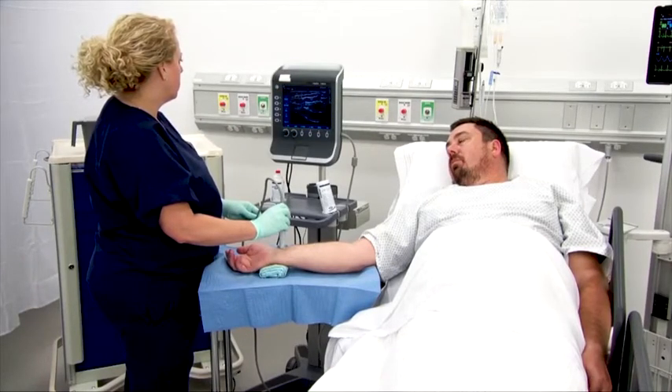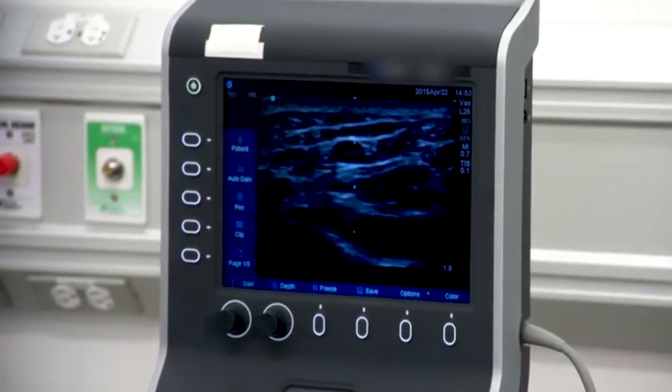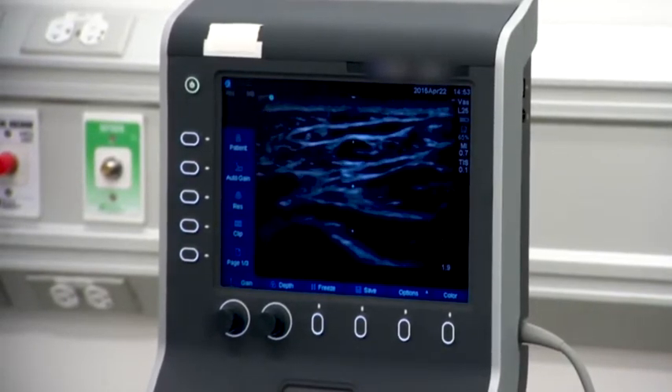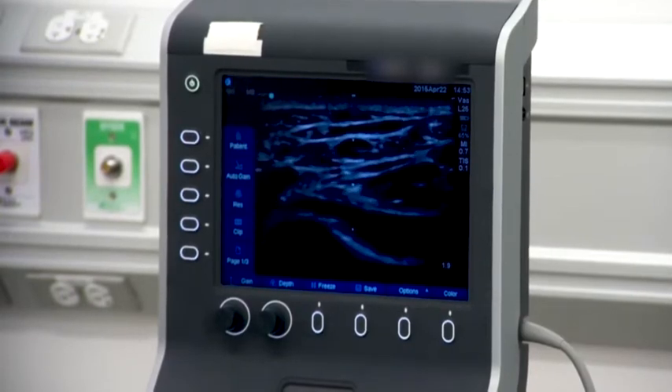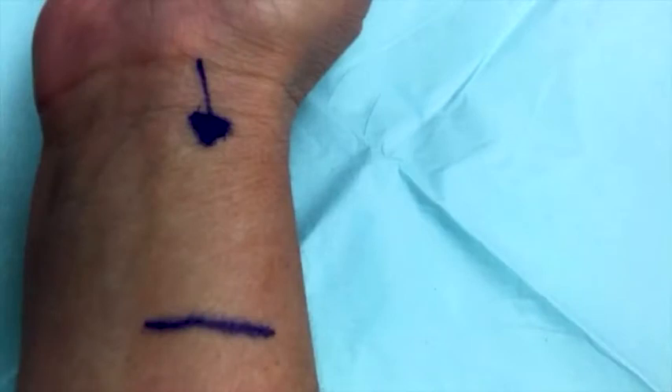Using the ultrasound probe, assess the intended insertion location for the optimal insertion site. Assessments should include the vascular anatomy, vessel depth, and nerve pathways that may inhibit a successful insertion. Avoid choosing a site that would interfere with the range of motion post-insertion. This zone shows the optimal insertion area for radial insertion to minimize mechanical complications.